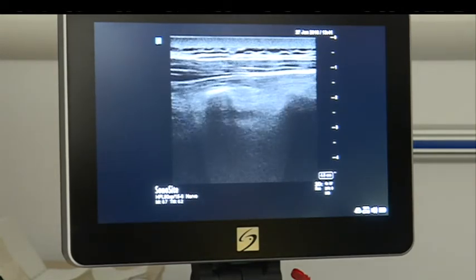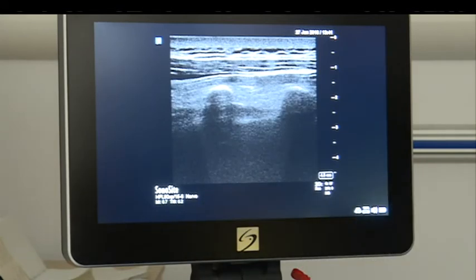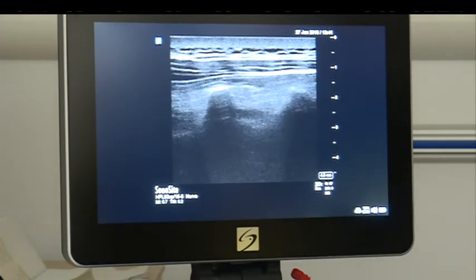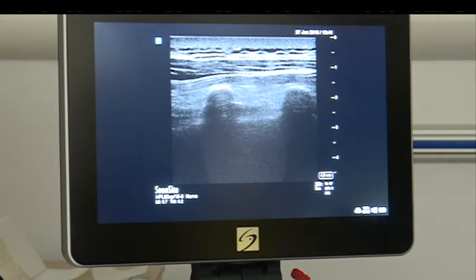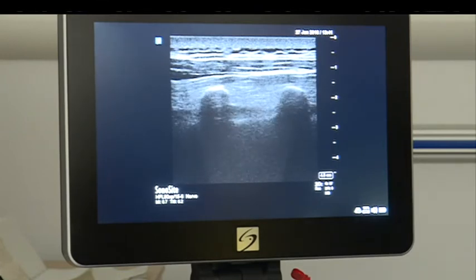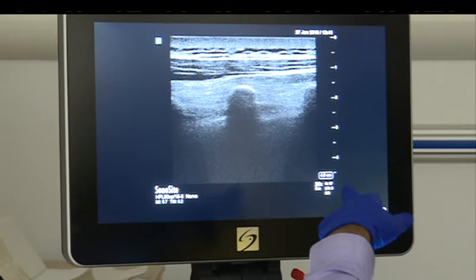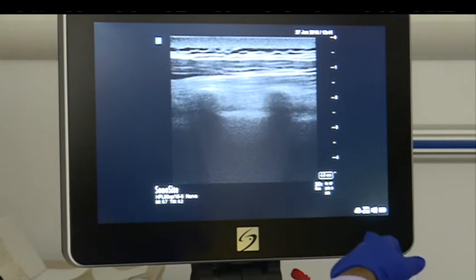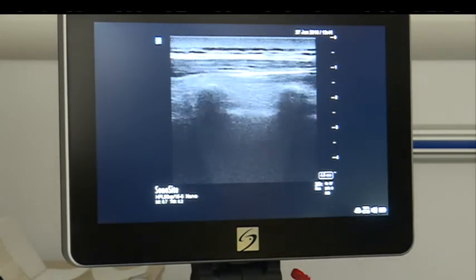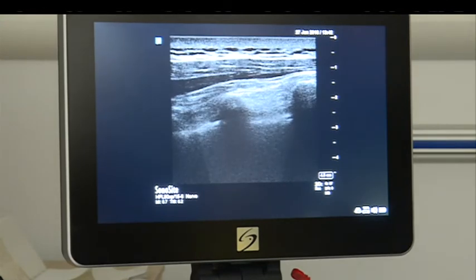What you see here now is the transverse process and pleura, and the costo-transverse ligament — you can see a thin white line above it. Basically you keep the rib away from you so you do not strike the needle to the rib. If you are coming from above, get the upper rib out of your way; if coming from below, get the other rib out of the way, so you do not hit the transverse process.